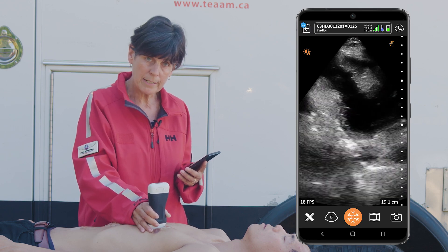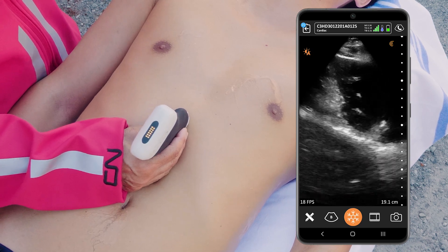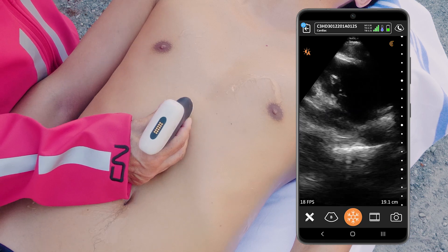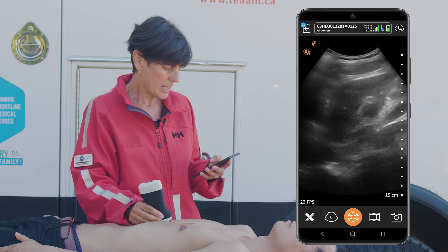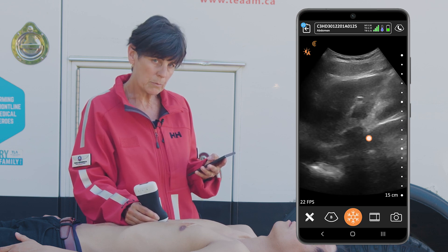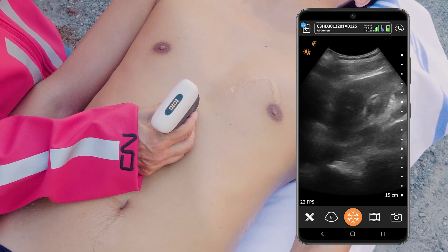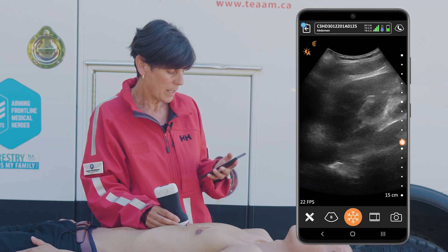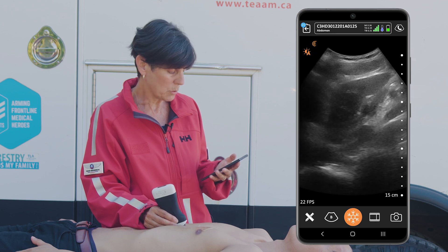Next I'm going to head down to the IVC, and from here we can assess the right-sided heart pressures and tell if the patient is hyper- or hypovolemic. I'm going to locate the IVC just in the midline — it's a nice dark tubular structure just a little bit to the right of the midline. What we're looking for is the size of the IVC; we can estimate it using the depth markers and we want it to be under two centimeters, and it's well within those limits.